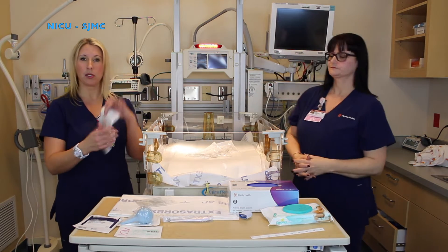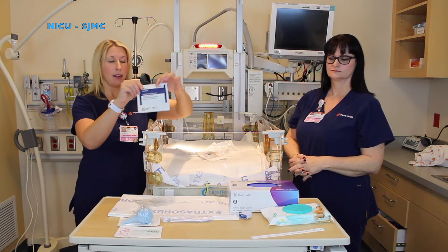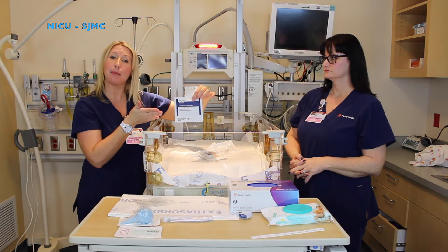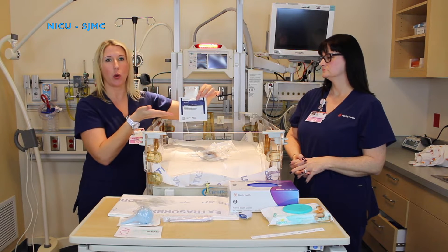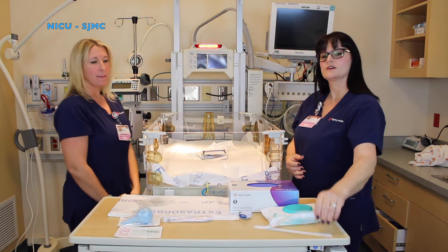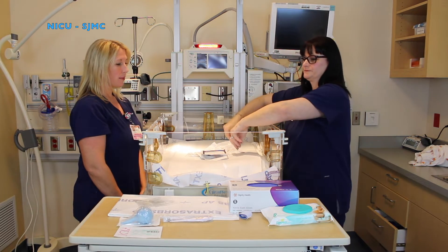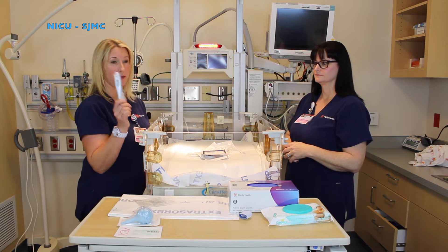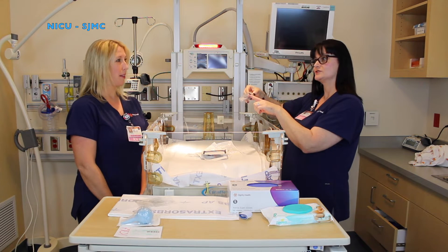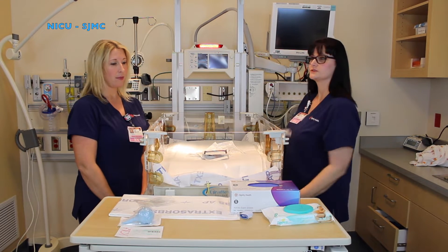You will also need a pulse ox and leads. Based on the size of your baby, these can also change. If it's a micro preemie, you will need limb leads. If it's a term child or a larger baby, they will use regular leads. You're also going to need a tape measure for head circumference and length. You will also need a thermometer, but remember not to place your thermometer inside your bed because it will get hot from the heat from the bed, so we'll place the thermometer in the drawer.